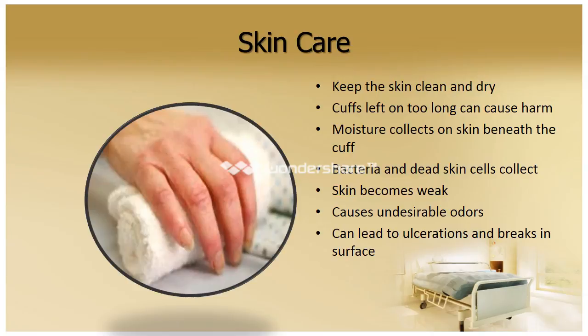It's important to make sure that our patient's skin is clean and dry. If you're not in an ICU area, then leaving the blood pressure cuff on is not a good practice. We live in a tropical state where the weather is much warmer. Sometimes if the sun is shining into the room, it makes the room much warmer than it would typically be. You want to be sure that these patients are comfortable and that the blood pressure cuff is removed after having the vitals taken.